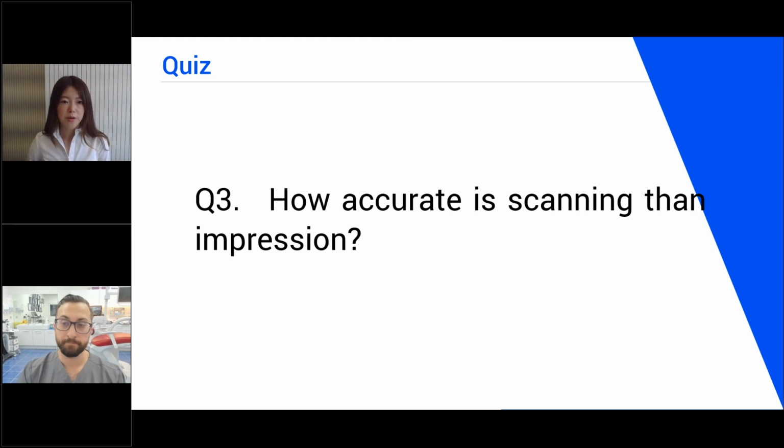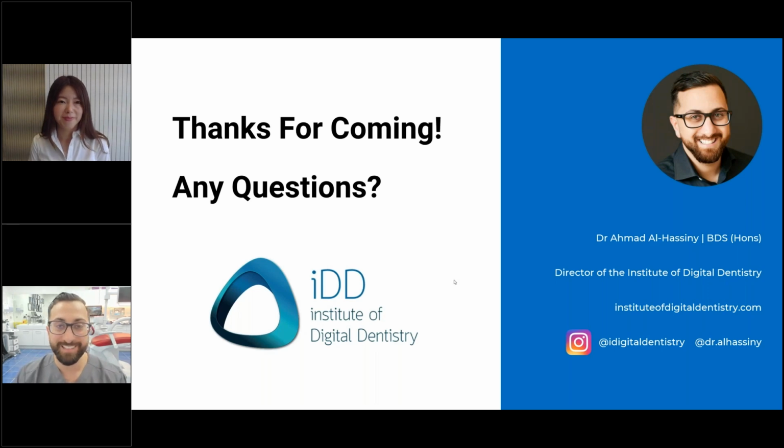Okay, question number 3. How accurate is scanning compared to impression taking? There's been, again, tons of literature on this topic. And look, anecdotally, I don't take impressions anymore, very rarely, except for full dentures, if the patient's completely edentulous. So in my opinion, from my personal experience of using scanners every single day, almost since I've graduated, I don't really need impression material anymore.